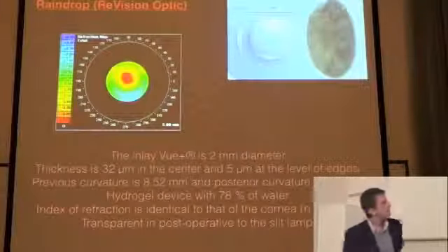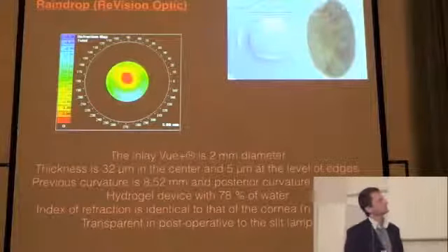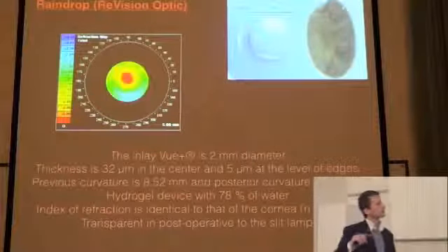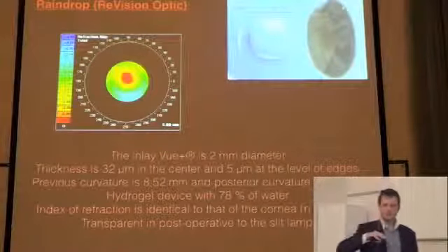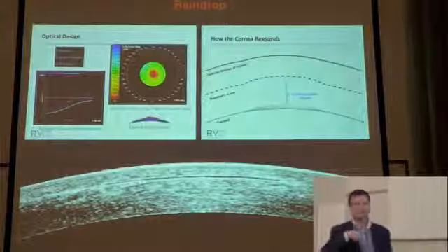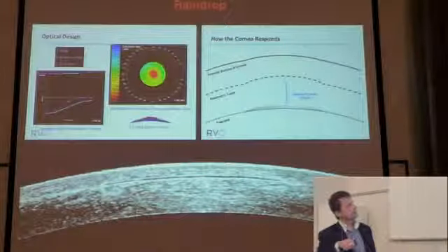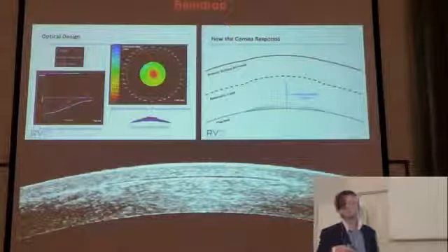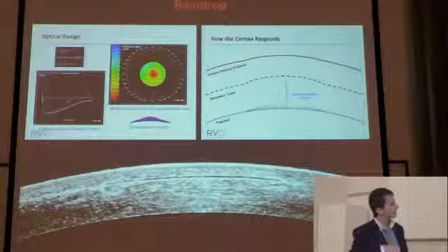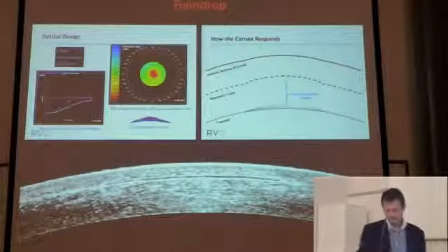Okay. Third, Raindrop from ReVision Optics. It's very small, 2 millimeters in diameter. It's very thin, 32 microns in the center and 5 at the edges. So you have a reshaping of the cornea, like this, that Mark showed you a few minutes ago. In fact, you have an improved asphericity of the cornea. And it's like presbyLASIK, as Charlie explained a few minutes ago. And with the OCT, you can see it inside the cornea. It's transparent.